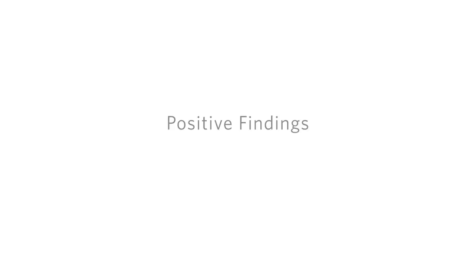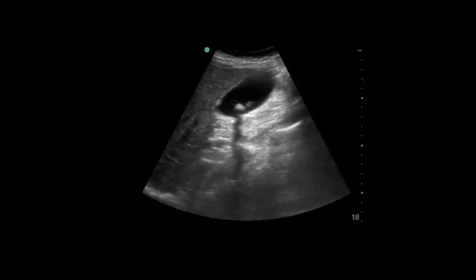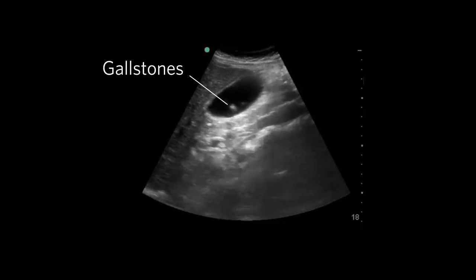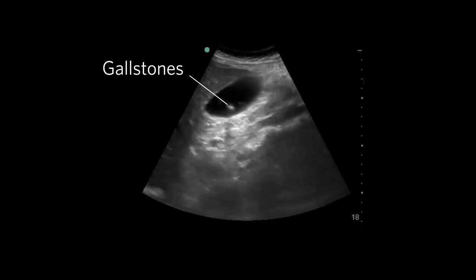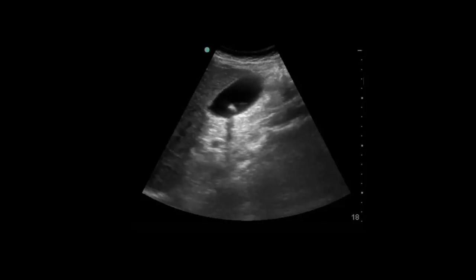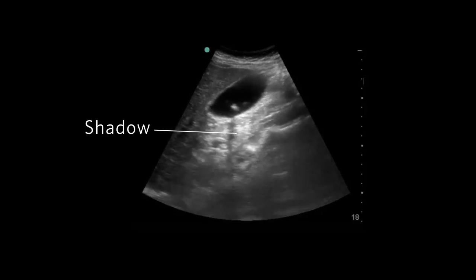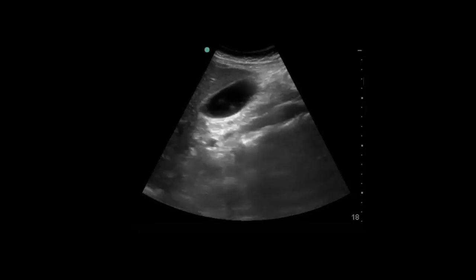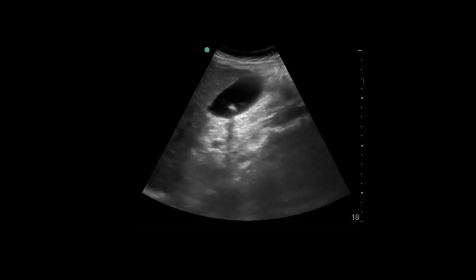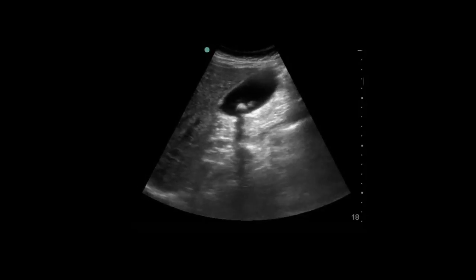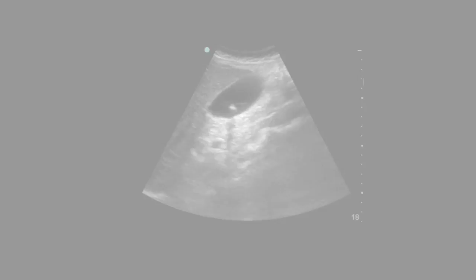Gallstones, if they are present, will appear as echogenic round structures inside the gallbladder and cast a prominent shadow. Notice the black shadow behind the gallstones imaged here. Gallstones are usually mobile, so you will notice that they move with patient movement, unless they are lodged in the neck of the gallbladder.